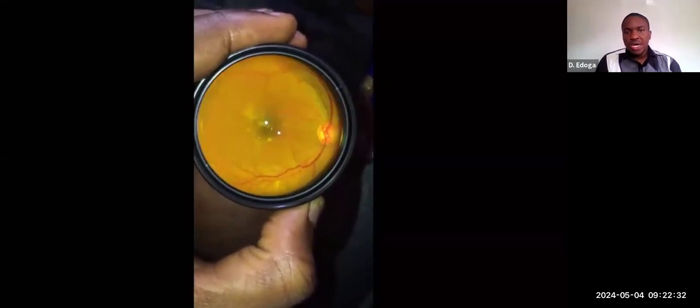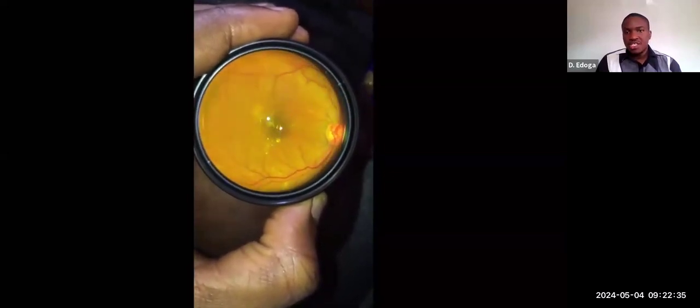By exposure, I mean how bright the image is. The higher the exposure, the brighter the image. The lower the exposure, the lesser the brightness. You don't need too much exposure, and you don't need too little exposure, especially when you want to image the optic disc.